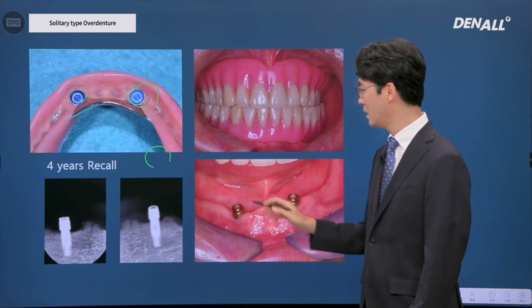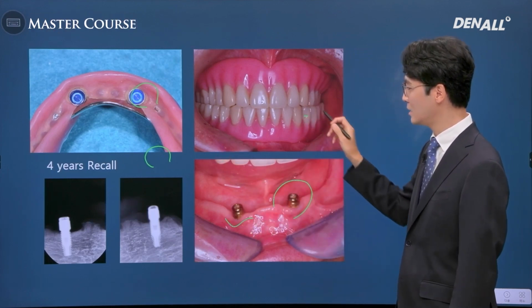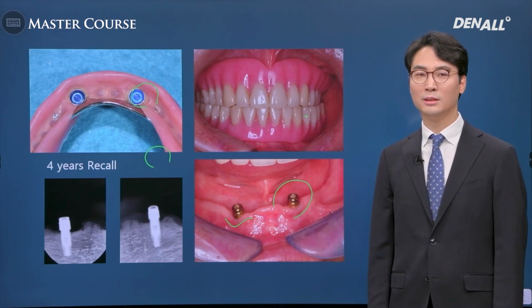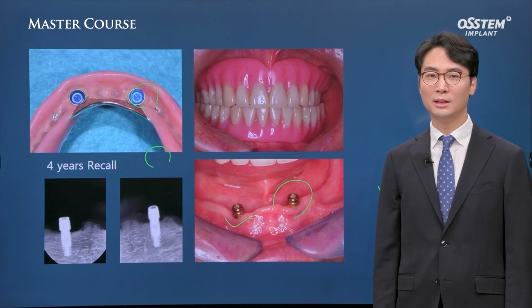This is after about 4 years. You can see that there's a bit of recession. The denture itself is nicely maintained, and the patient was very satisfied with the retention and occlusal function.